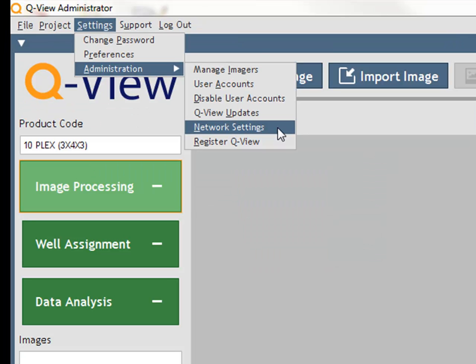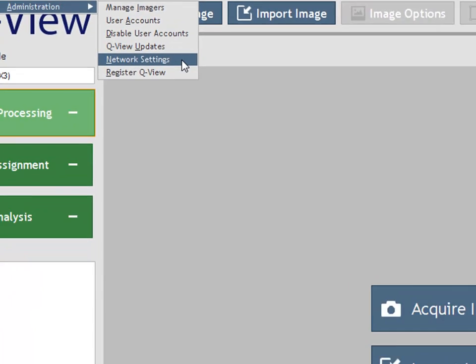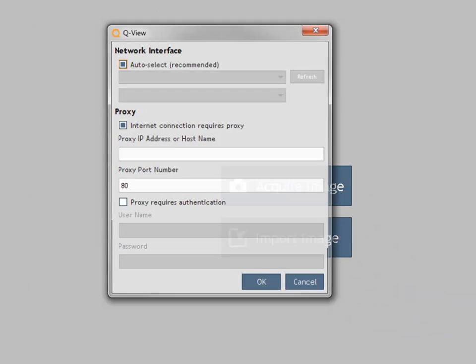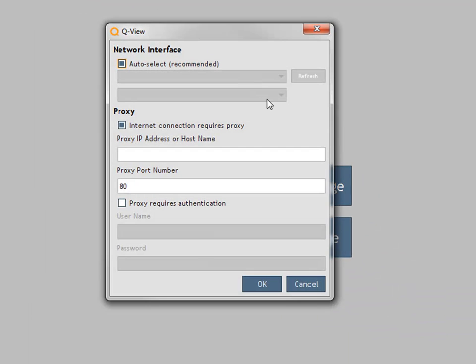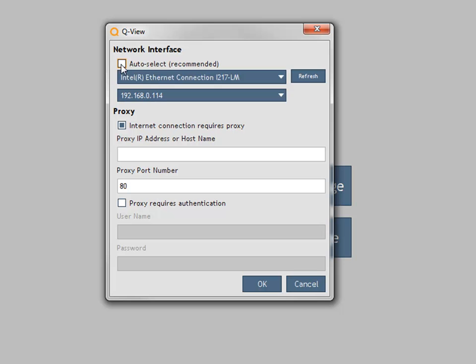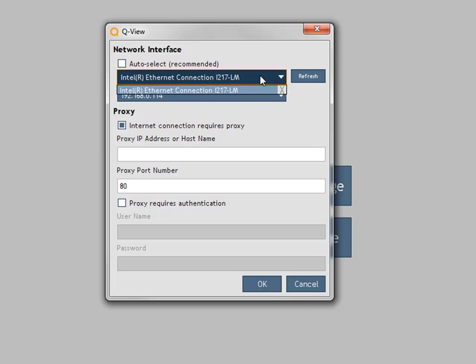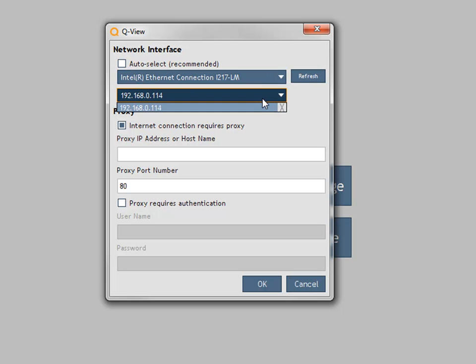Network settings allow you to specify settings for internet access for QView updates. If the computer running QView has multiple network devices, you may need to manually select the device that has access to the internet in order to receive updates. To select a network device, deselect the Auto Select checkbox and choose the network interface and IP address from which internet traffic will originate.